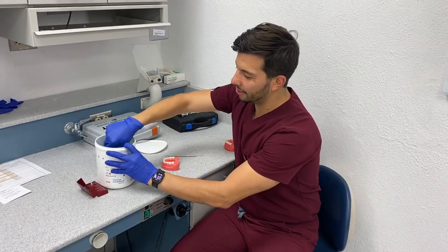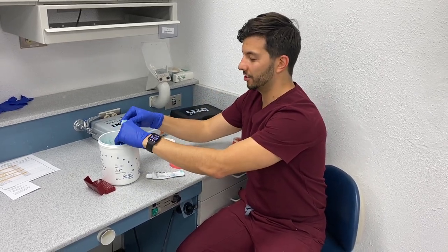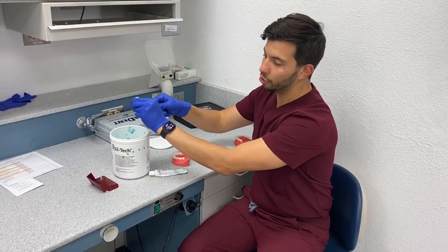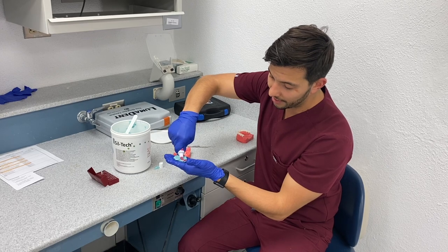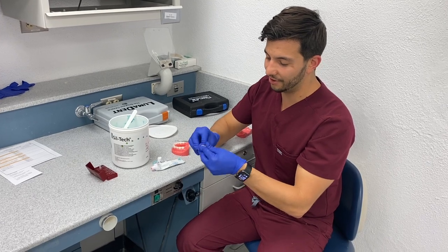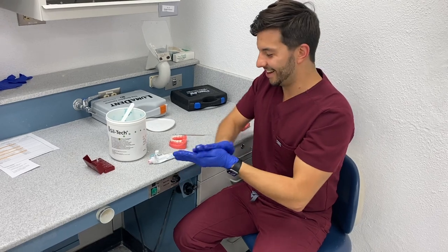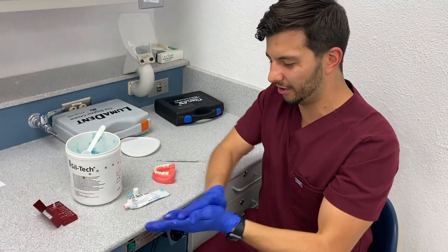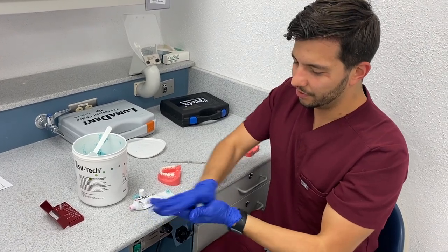Before getting started, to measure the occlusal reduction — that 1 to 1.5 millimeter reduction — we're going to want to have a putty matrix. Essentially you're going to want to get about a full scoop of this. Most professors and faculty will tell you to just do one line, but I personally like to do a second one because it'll help it set a lot faster. You want to make sure that you're using gloves. You don't want to be touching this with your hands — it'll get really oily and that's not how you want to start your prep.